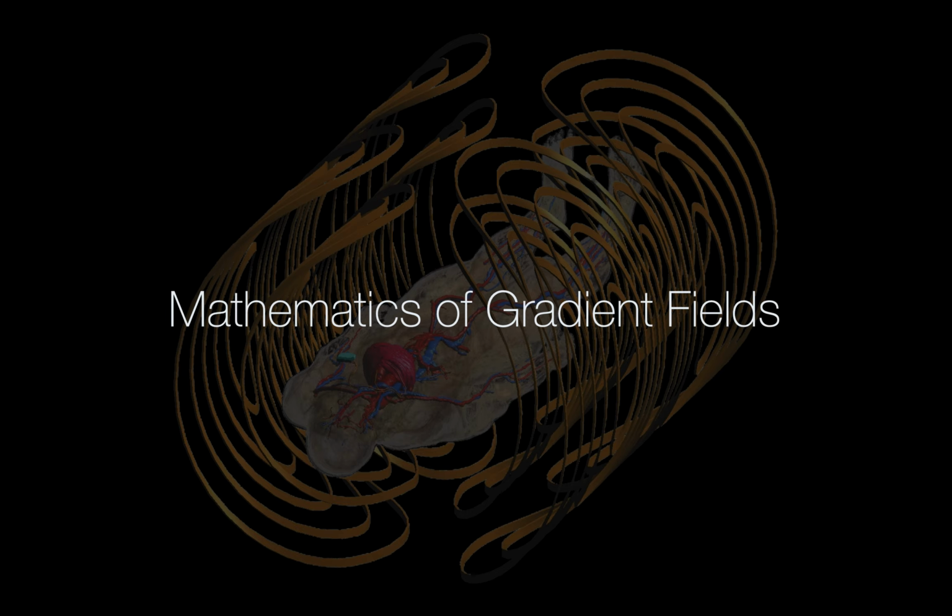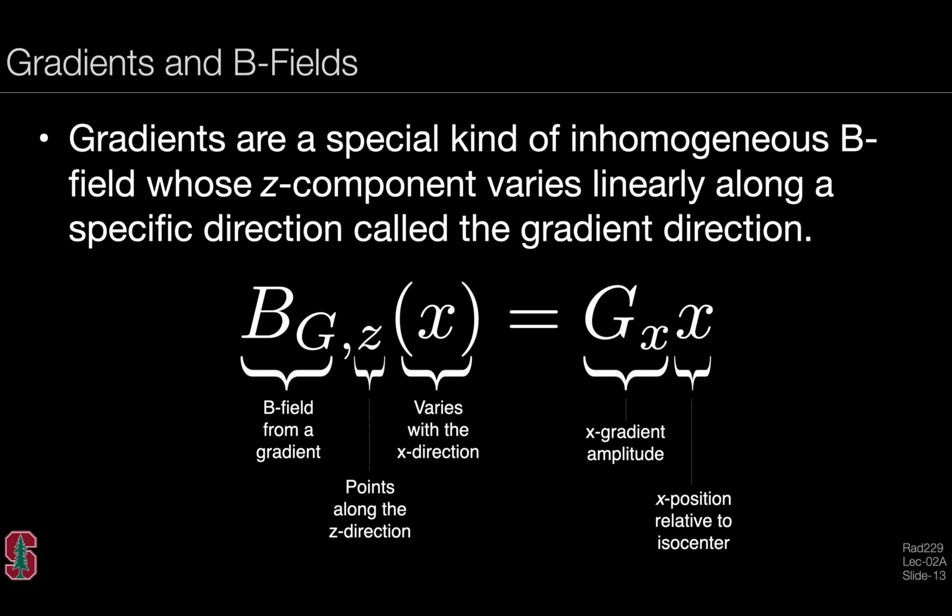Okay, so that was some nice overview qualitatively of what magnetic field gradients do. Let's look more carefully at the mathematics of gradient fields. So gradients are a special kind of inhomogeneous B field whose Z component varies linearly along a specific direction called the gradient direction. And this is a little bit cumbersome to look at, but let's break it down.